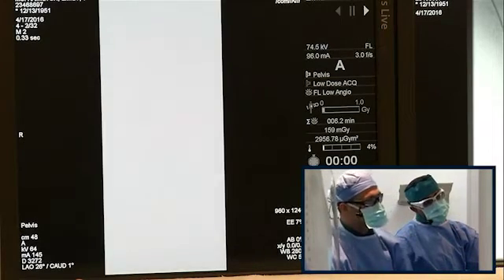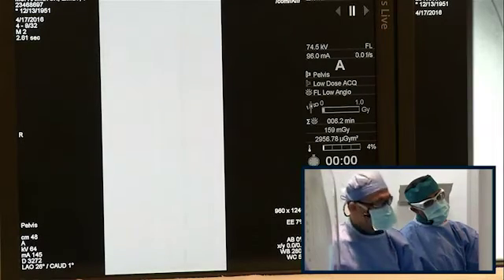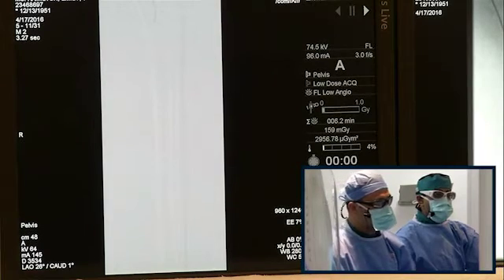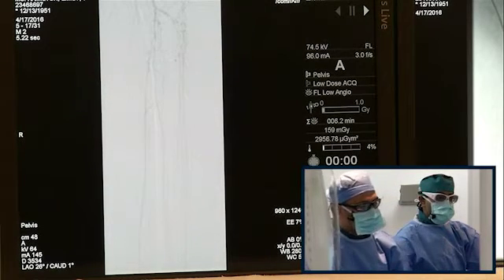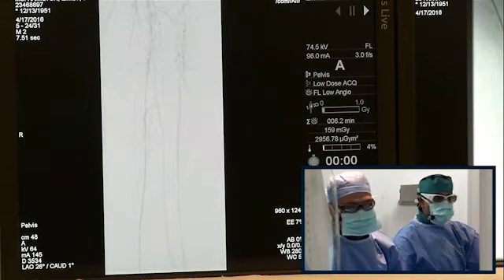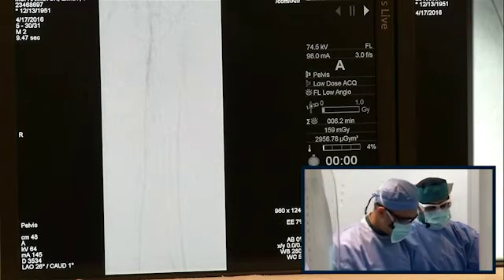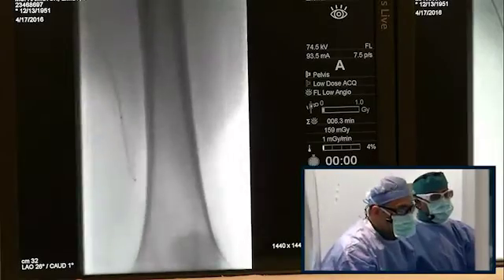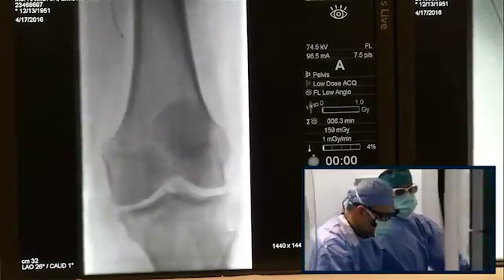And then going down, we have a better picture here. There is some proximal AT disease and TP disease. You need to get down and get a better picture of that. But it seems like there is some proximal disease. Just wanted to show that. Go ahead, Bruce. I'm sorry.